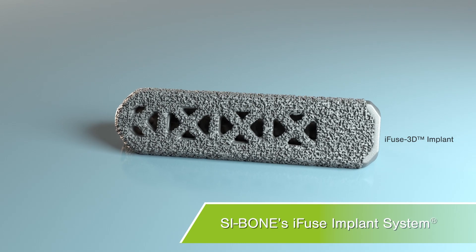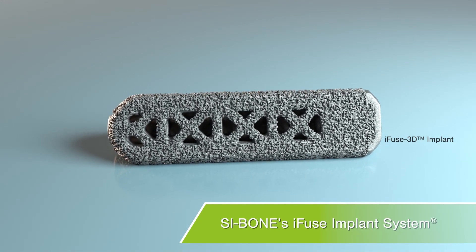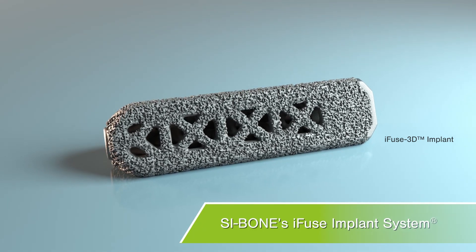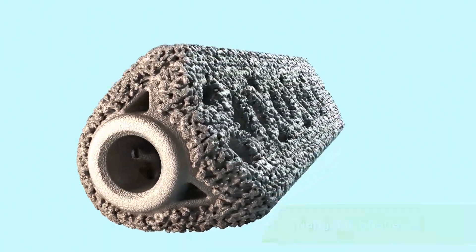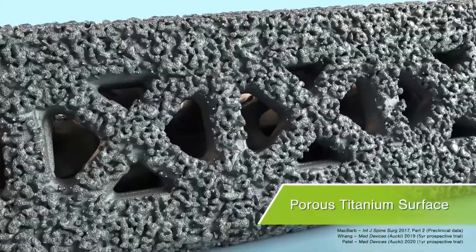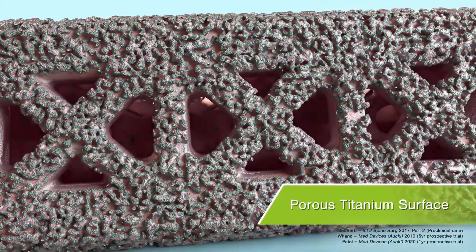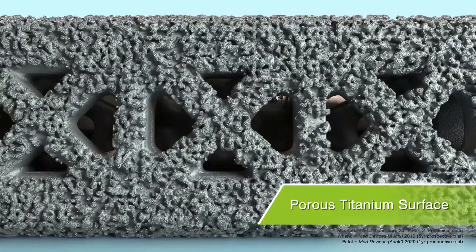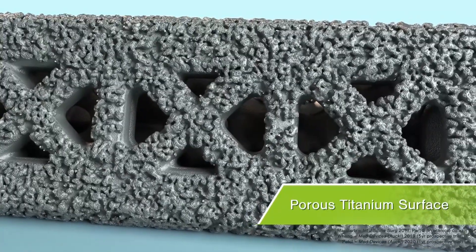SI BONE's iFUSE implant system was designed specifically for minimally invasive stabilization and fusion of the SI joint. The triangular shape of the 3D printed titanium implants provides immediate joint stabilization. The porous surface and fenestrations allow for bone to grow on, in, and through the implants for long-term fusion, as shown in both preclinical testing and CT scans in patients participating in clinical trials.